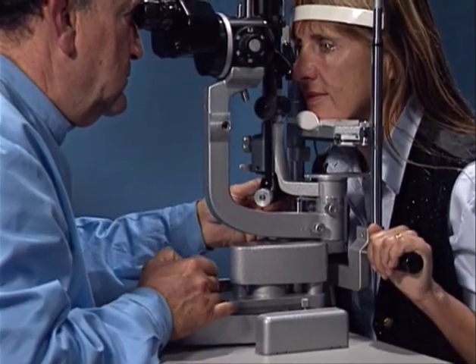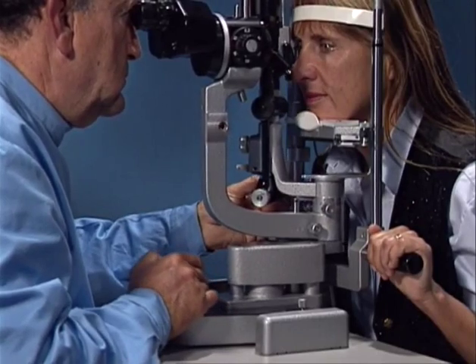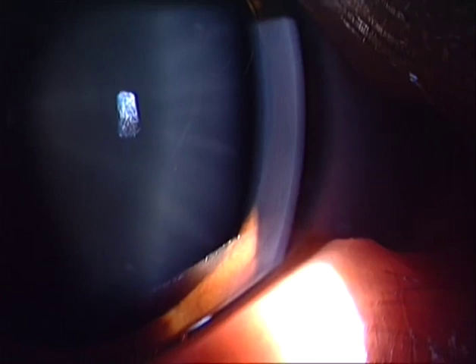Now again, the examiner's head is comfortable and the instrument base only is shifted. In the examination of the anterior lens surface, for example, the slit lamp is guided along the lens surface from the right to the left until the point is reached where the reflex eventually appears.